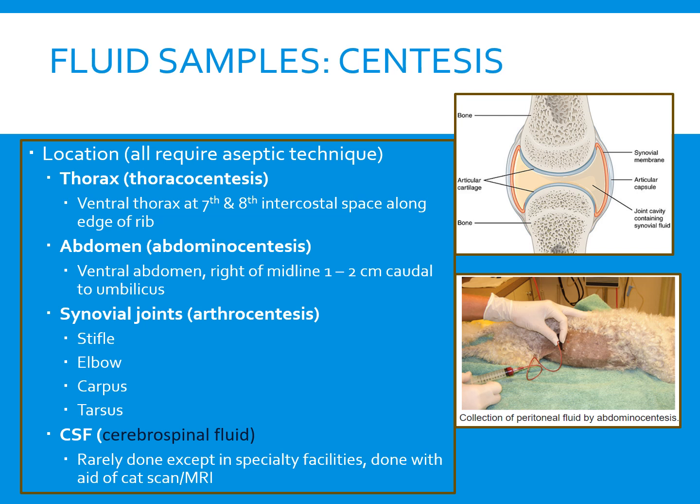before we do either one of those, the site needs to be aseptically prepared, and all equipment and supplies should be gathered and ready. Preparing several smears from the fluid as soon as it's collected is helpful so that we have a plentiful supply of glass slides. A portion of the fluid should be collected in an EDTA tube. A 21 gauge needle is most commonly used and should be attached to a 60 ml syringe.